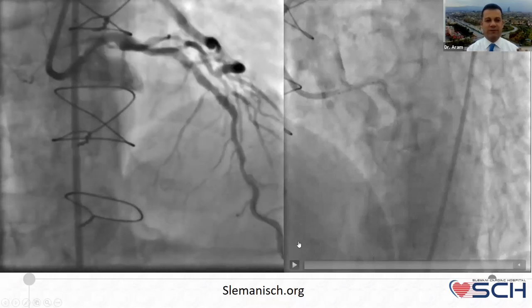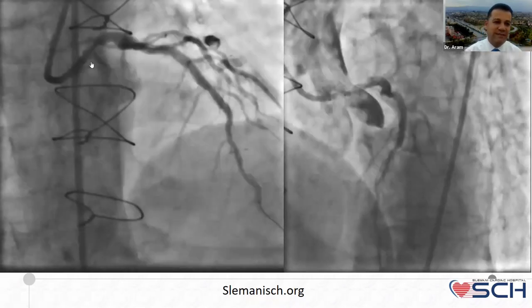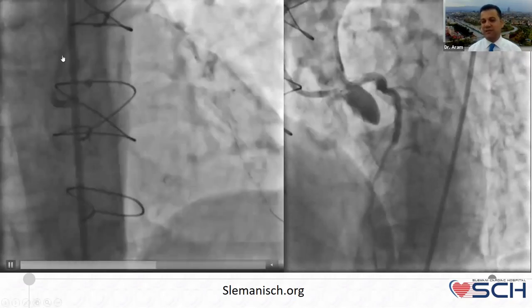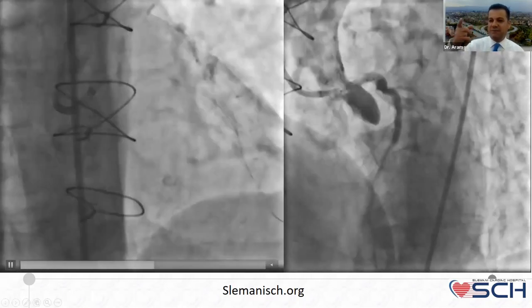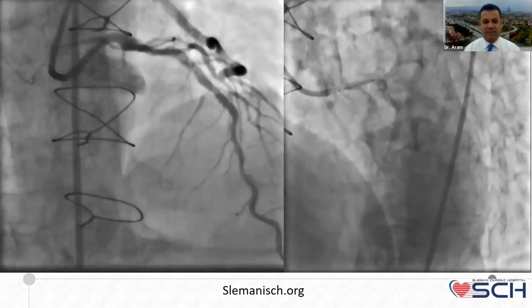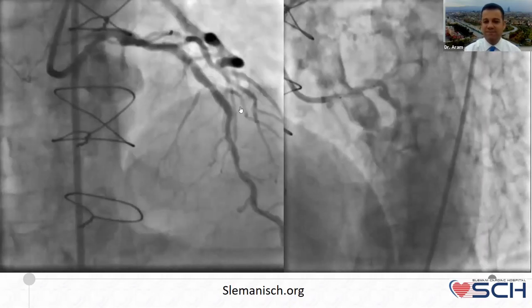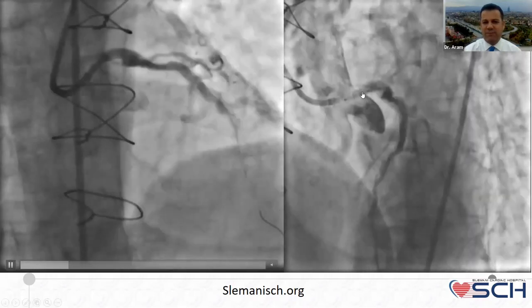That's why all the time, but in this case, as long as we have a critical lesion at the ostium of the left main, at that time we cannot have a guide like extra backup to be deep seated because of the ostium of the left main. And this is the mid part. We show that after balloon dilatation and stenting for the left main, and finished by POT, and this is the final result.